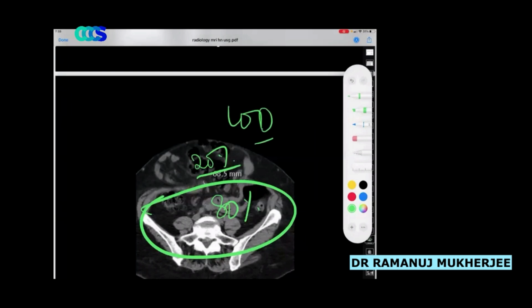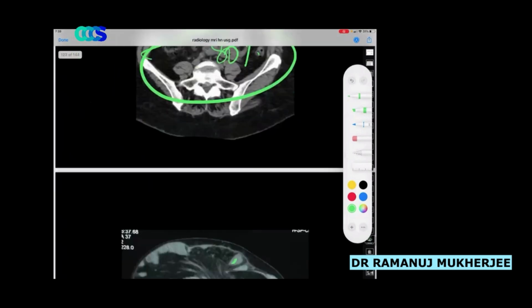And then some people will do a progressive pneumoperitoneum for treatment of this part. Okay, so this goes on to complete this part again.